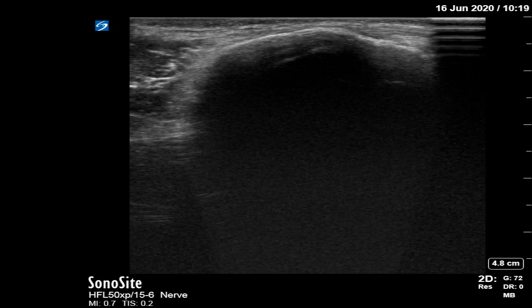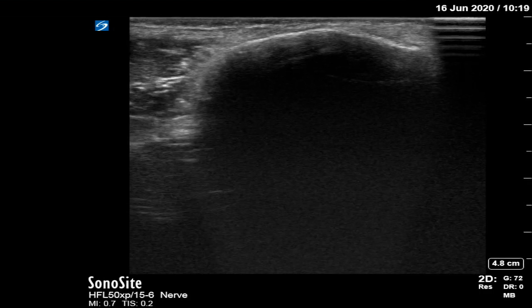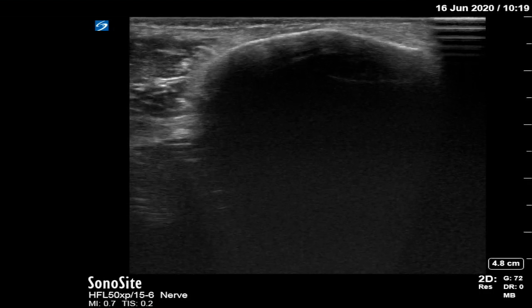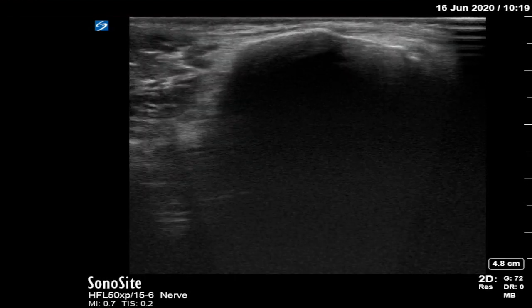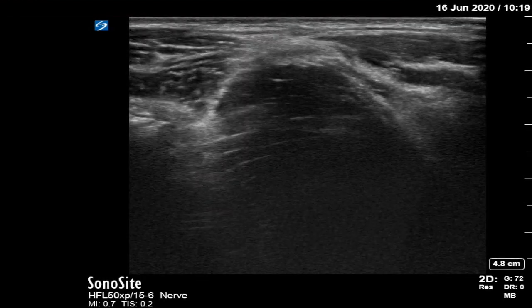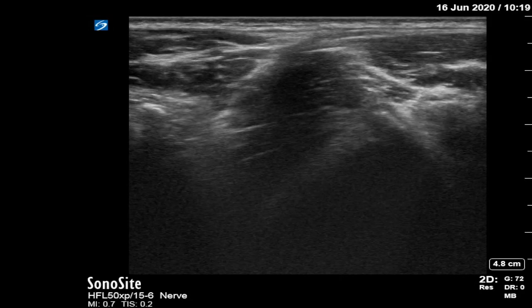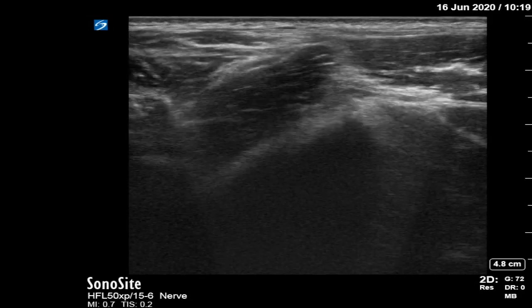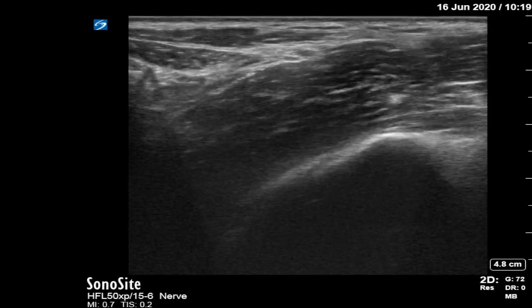Now we look at some of the images that can be obtained when the probe is maneuvered in the way demonstrated. Here we can see the probe begins over the anterior superior iliac spine. It is initially moved medially and then with a small degree of rotation, we are soon able to get a clear image where we can identify some key structures.